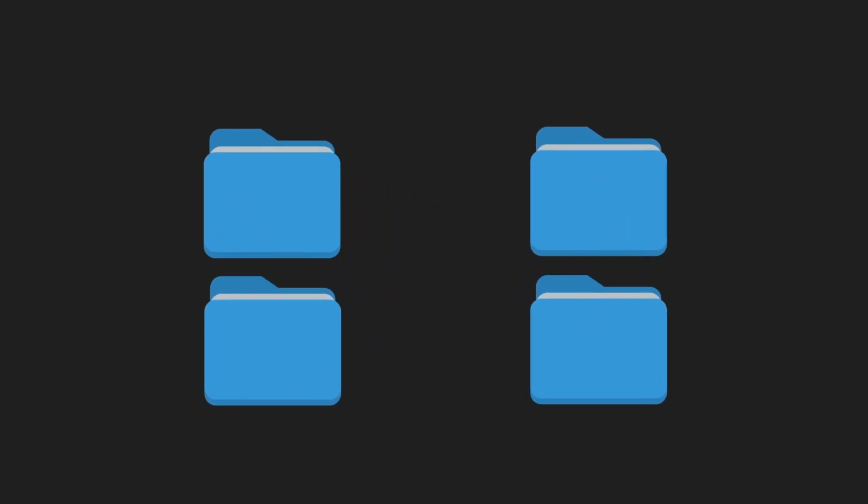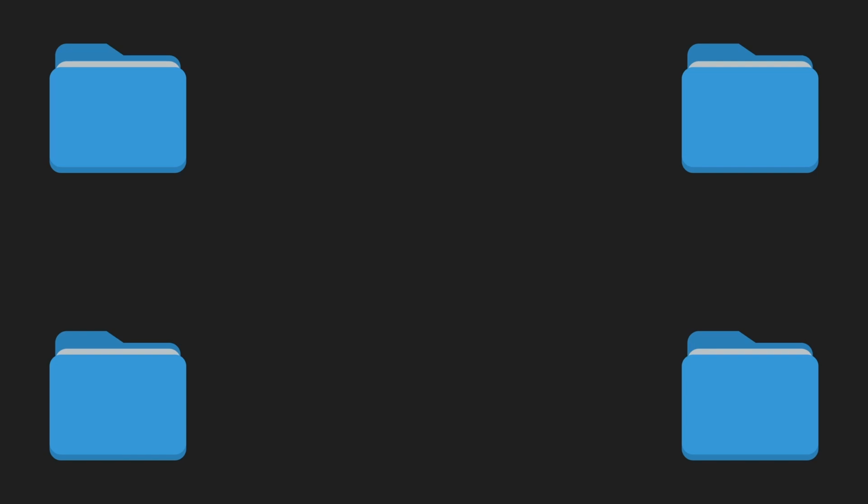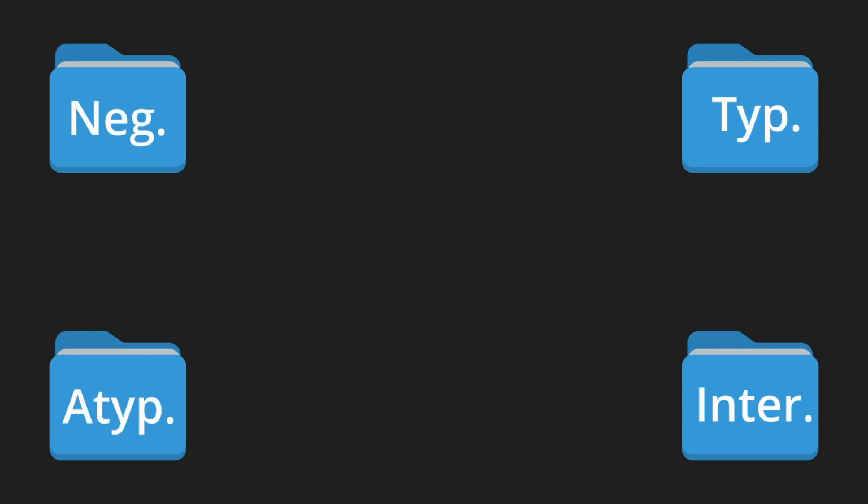In order to figure out what amount of files to fill and cull, we first need to double the amount of files in the smallest category. For example, if the smallest category, let's say atypical, had 49 files, at the end we would have 98 atypical files. Although doubling the amount of files isn't as simple as just copying the file with a different name.